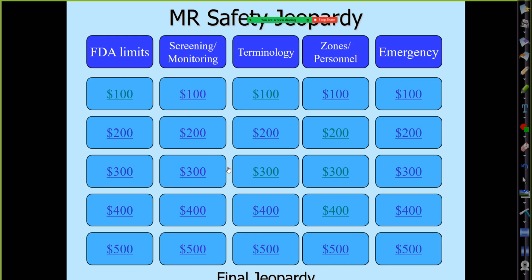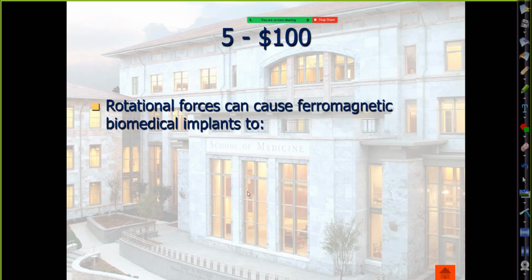Drew, staying on you, what you got? Emergency for 100. All right. Rotational forces are due to? Torque, yeah, twist, rotate.